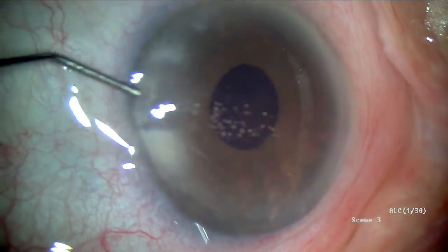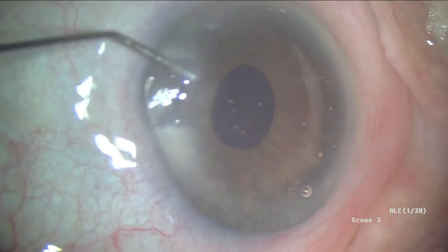Overall, it's been an exciting treatment option for our patients with cataract and open-angle glaucoma.